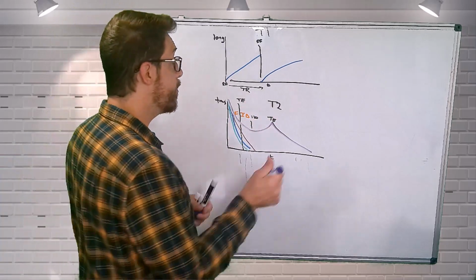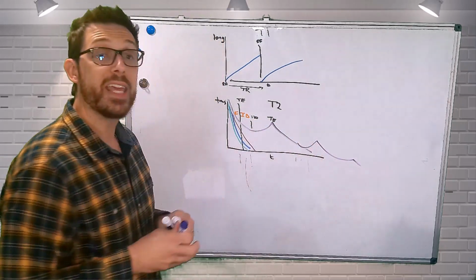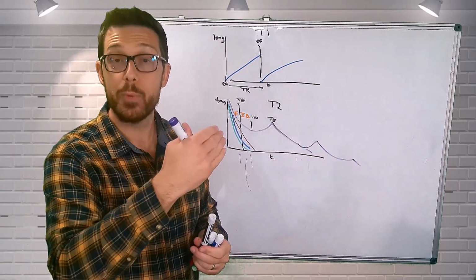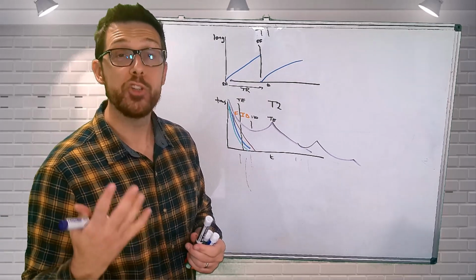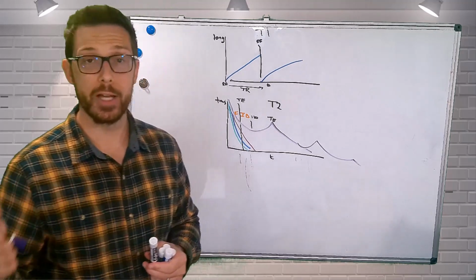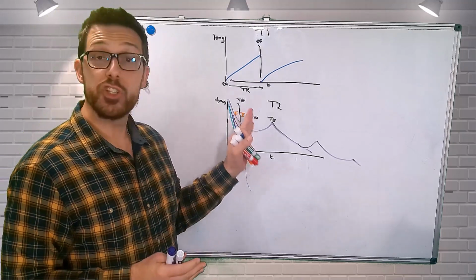And I can do this multiple times and create an image of these TE times that we've sampled as the signal is decaying, and create a more accurate representation of what's happening to our transverse magnetization. And this leads to true T2 contrast. It's more accurate than using just free induction decay.